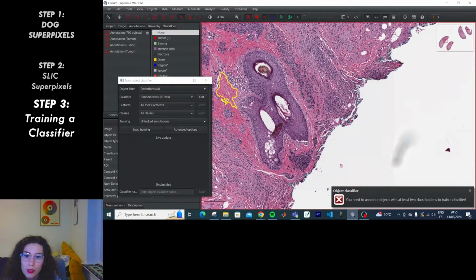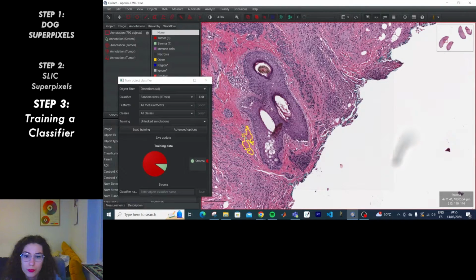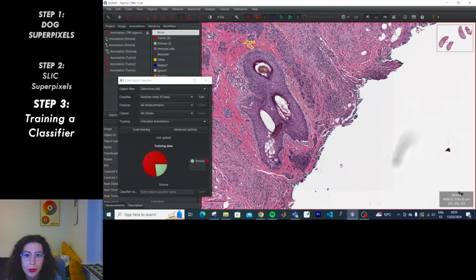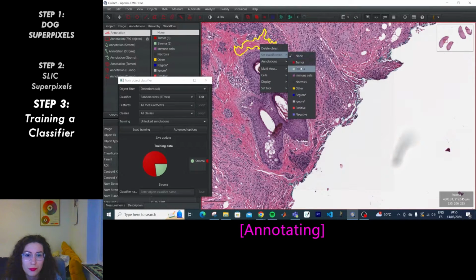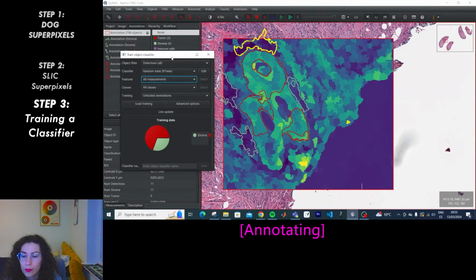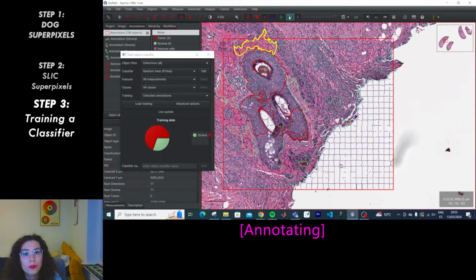Wow. That this is stroma. I'm so sorry, pathologist watching this. If I'm making mistakes, I'm not doing it to annoy you, I promise. There you go.